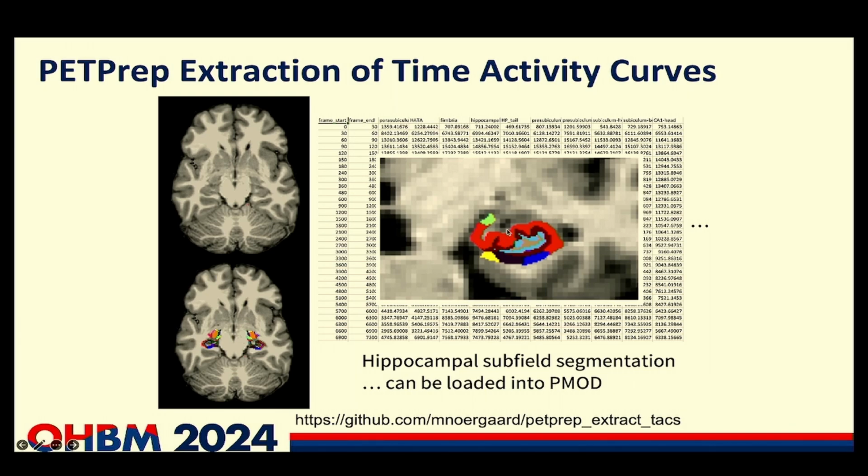You can always discuss the use of partial volume correction in this, and you should be mindful about that as you go down in region size, you will have more partial volume effects, and you will also have more noise because you have smaller regions. Nevertheless, this can still be done, and again, it's up to you as researchers to decide whether it makes sense.